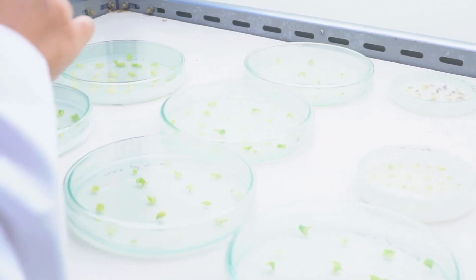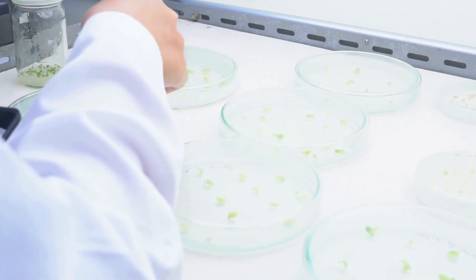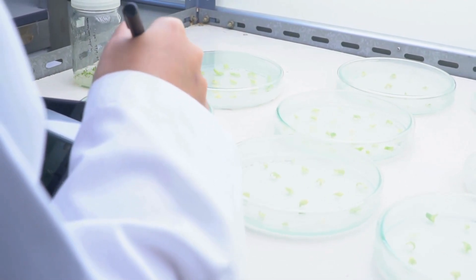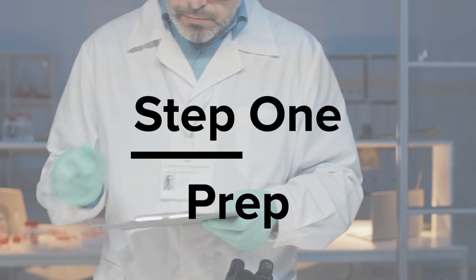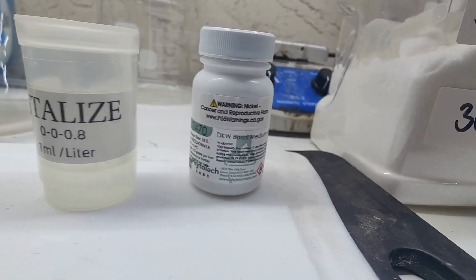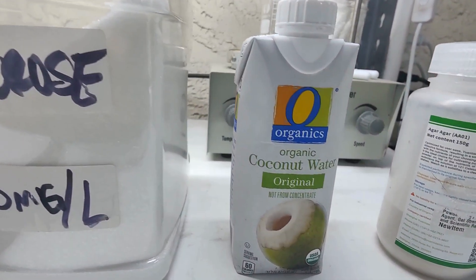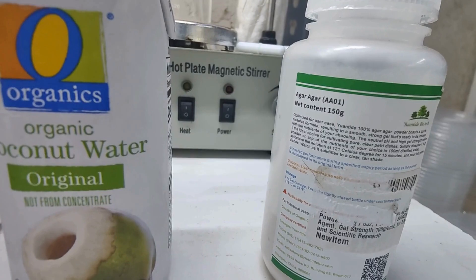Let's make some tissue culture media. Questions I get asked all the time: how do you make your media, where do you get it, what do you put in it, why is it called agar agar, how much do I add, do I use hormones? We're gonna get into all that right now. We're gonna start with a silica source — in this case Vitalized — 4 mils, our DKW basal media with vitamins, sugar as our carbon source, organic coconut water which has sugar and a bunch of great hormones, and then our agar.